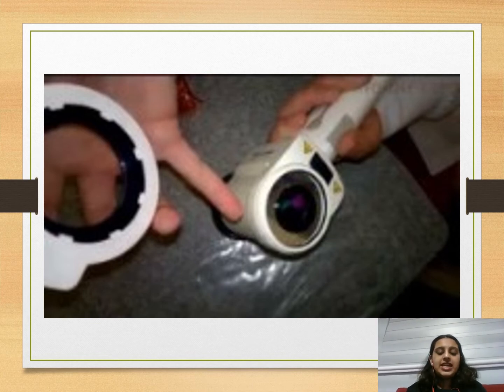So make sure you just say, "Hey, I noticed that you have a history of using tobacco. I want to use this, for lack of a better word, like a camera or a screening tool, just to see if there are any lesions that are a little bit out of the ordinary." And if I find that there's something out of the ordinary, I want to confirm with my dentist, and either we'll book you back in 2 weeks to reevaluate and see if it's getting any better, or if not, we'll refer you out, and then we'll get a better idea.